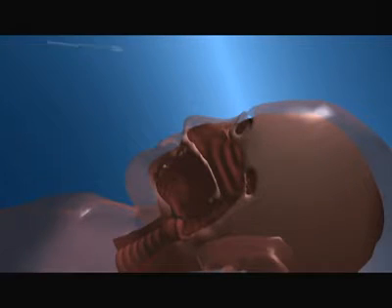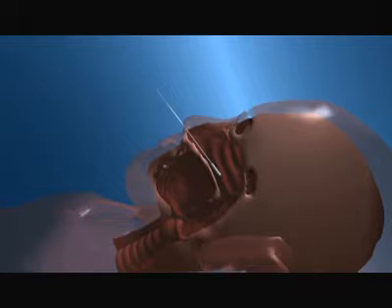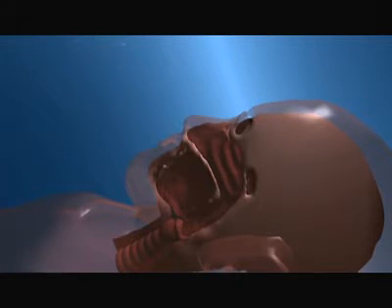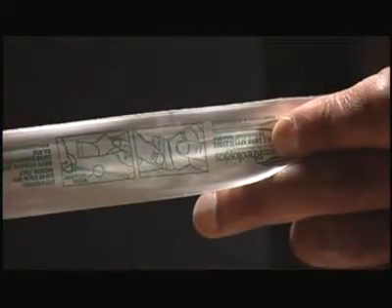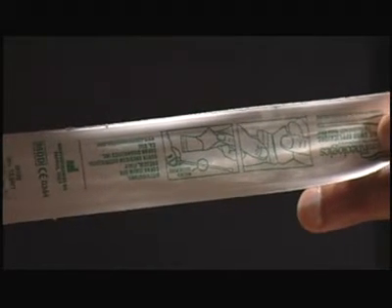Consequently, collection of a nasopharyngeal swab rather than a nose or a throat swab is more likely to test positive for one or more of these agents. These are the nasopharyngeal swabs, which come in packages. Each swab is separately packaged in a sterile blister wrap, and the swab should be stored at ambient temperature away from sunlight or other heat sources. The expiry date is located on the base of the swab, and swabs should not be used past this date.